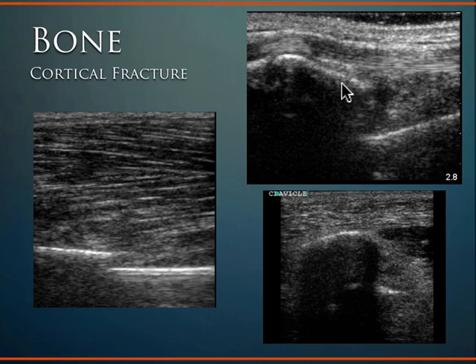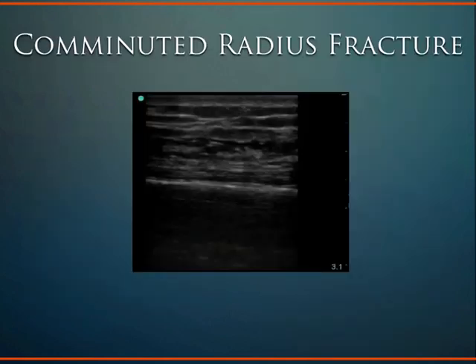It'd be nice if they were all this obvious. They're not always all that obvious, when you're looking at that top right picture. And then this distal clavicle fracture, a very, very common step-off type appearance and displacement of the bony fragments.